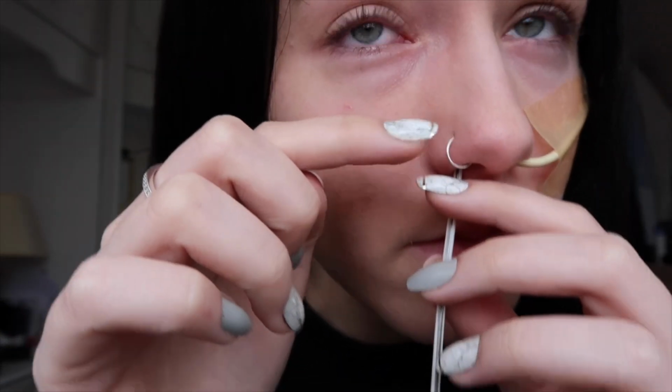If you press down so it's flat against the track of your nose, that will help. You see my eyes watering? Right, so just keep threading. It's at the back of my throat, so I'm going to grab the water. Oh, my eyes are watering so bad. I'm going to take a sip. And then push.